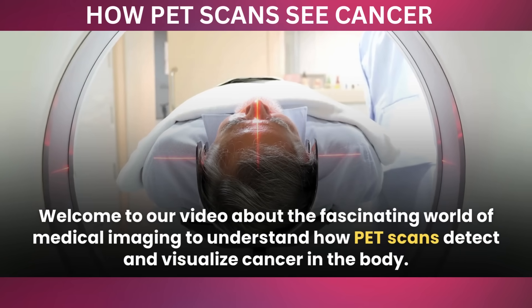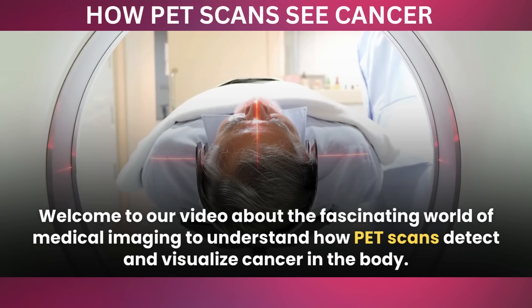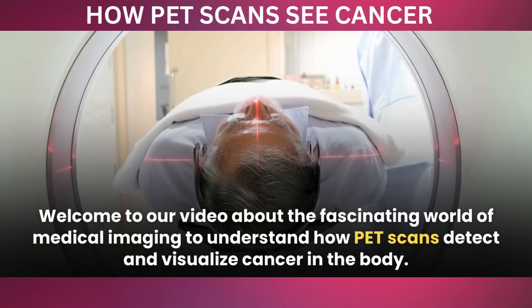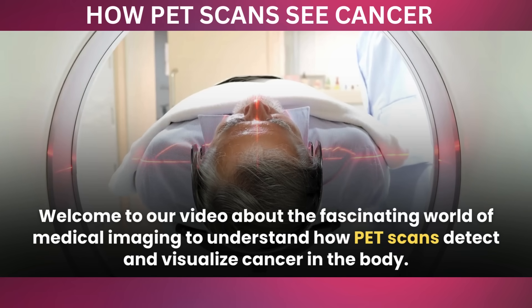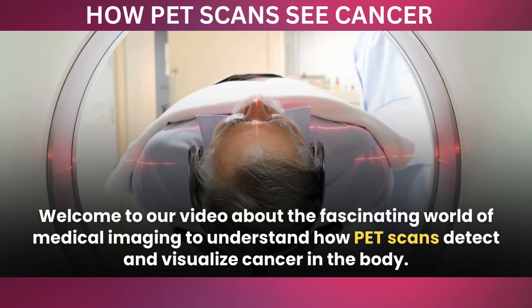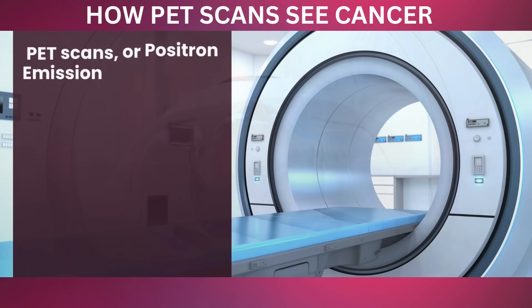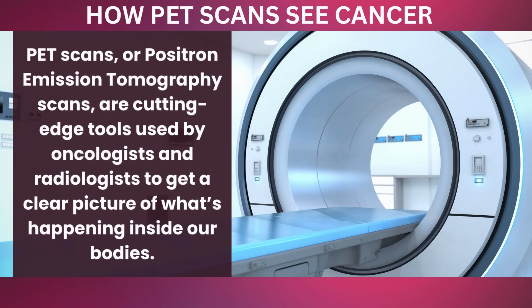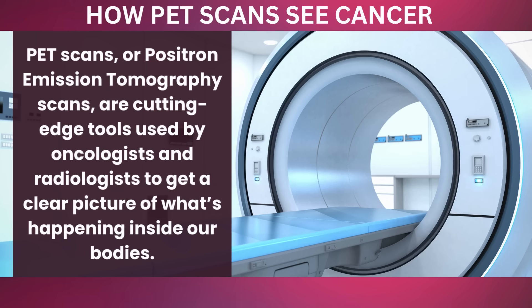Welcome to our video about the fascinating world of medical imaging, to understand how PET scans detect and visualize cancer in the body. PET scans, or positron emission tomography scans, are cutting-edge tools used by oncologists and radiologists to get a clear picture of what's happening inside our bodies.